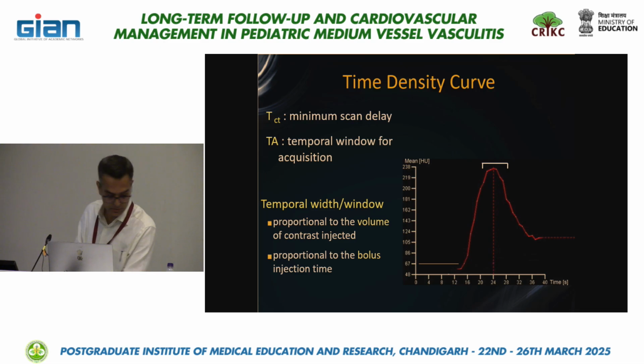That delay amounts to the inherent scan delay, followed by the peak enhancement and the temporal window for acquisition. So this temporal window, we have to acquire the CT during this period only. This window can be broadened or narrowed depending upon the protocol, how fast we acquire, how slowly the injections are made, or how fast the scan is taken.